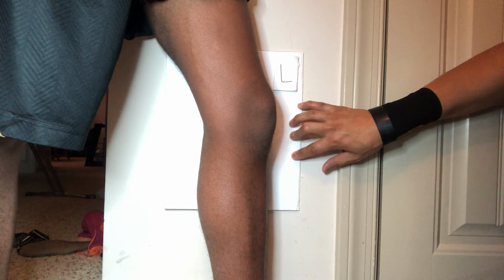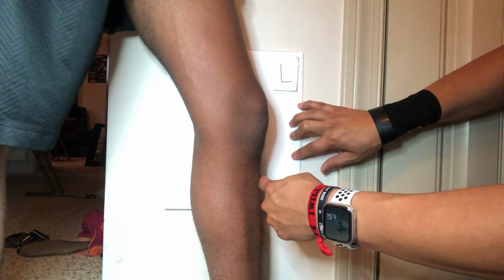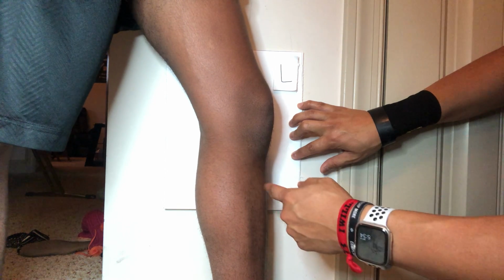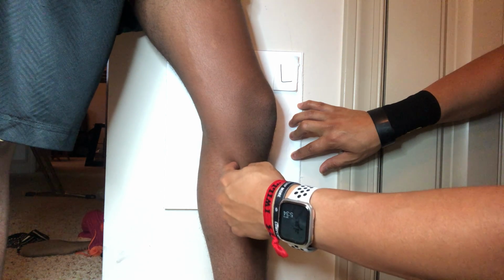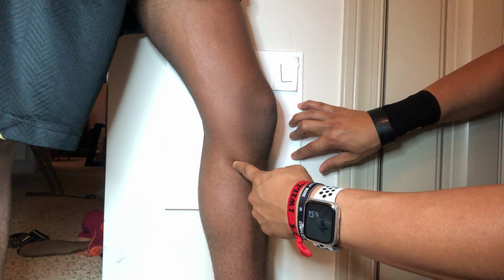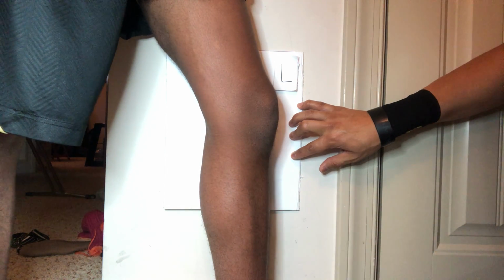Now, the central ray is also going to be a ½ inch below the apex of the patella through the center of the film space. However, since it's lateral, it's going to be more about perpendicular with the medial epicondyle. We're going to collimate to include the distal femur, patella, proximal tibia and fibula, the joint space between the tibial plateau, and the interspace between the condyles and the patella.